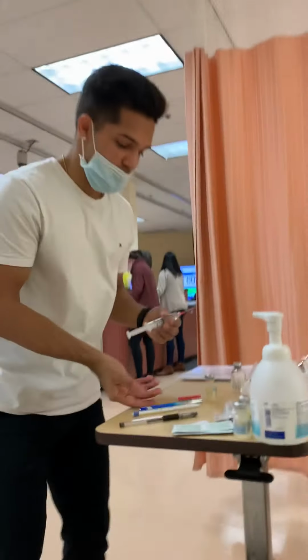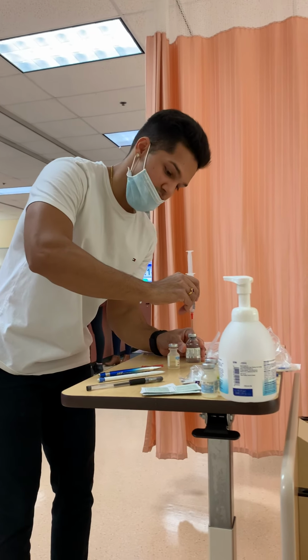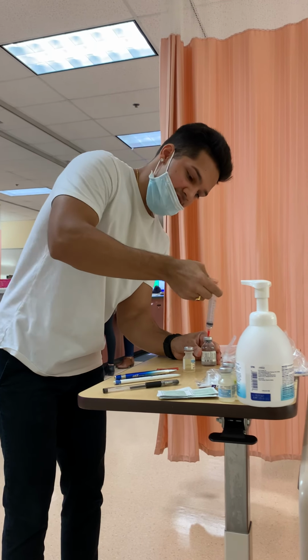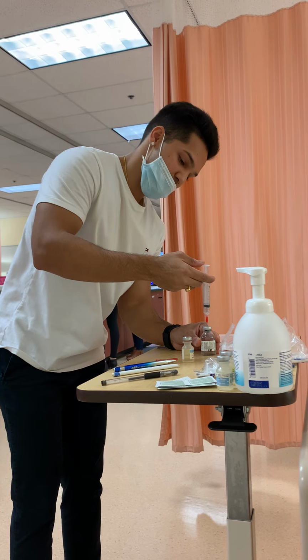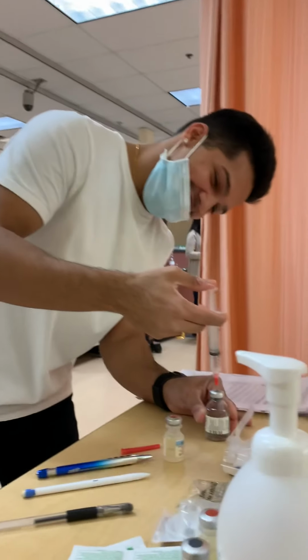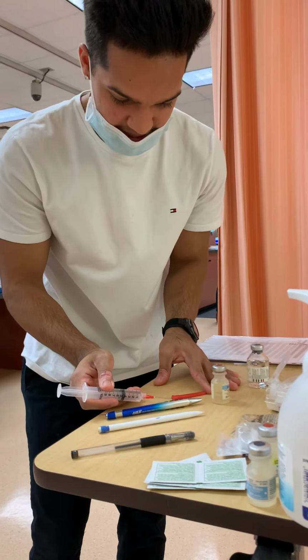Now I'm going to be injecting that right into my medication vial, and I know the top of my medication vial is clean because I wiped it already. I'm injecting it into my 2 gram vial because that's what the parenteral drug monograph says. Now I'm going to let the air drop back, and once I let the air drop back, I'll just scoop this.